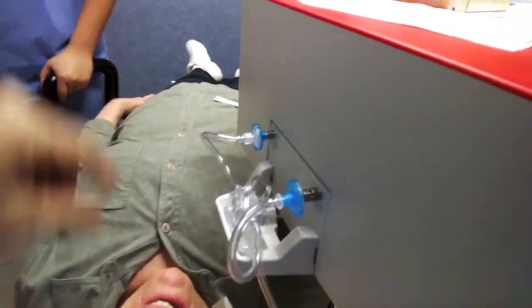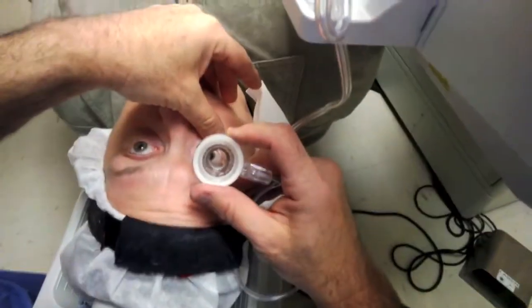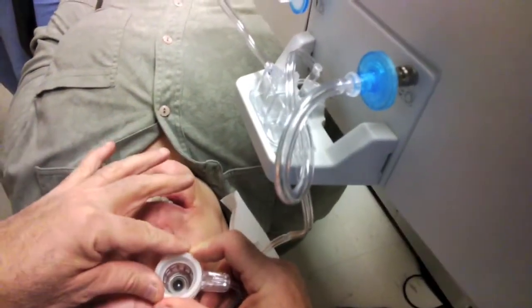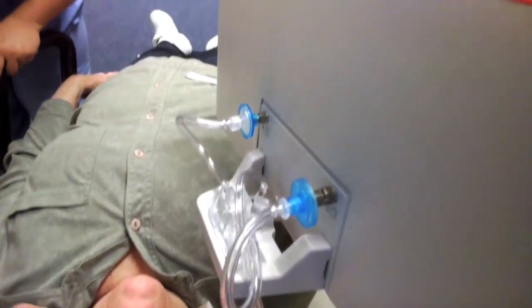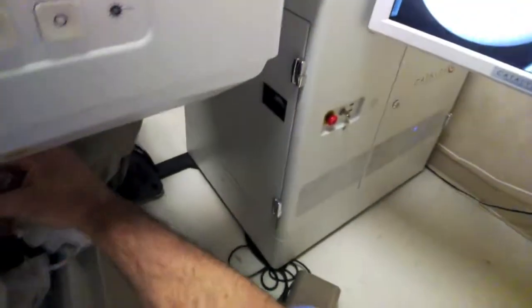Let's get started. The first thing we do is attach it to the laser. There's a red spot up on the ceiling — can you see that up there? Just look at that. We'll put some cool saline on your eyes now. Try not to move. We're going to pull you underneath the laser, get you coupled with the laser, and we'll get started.